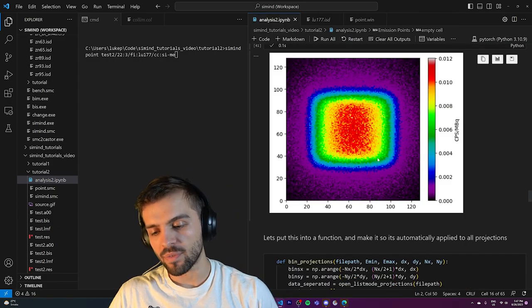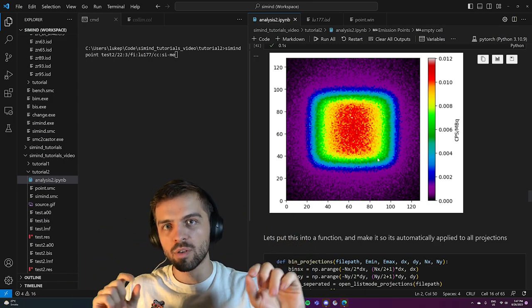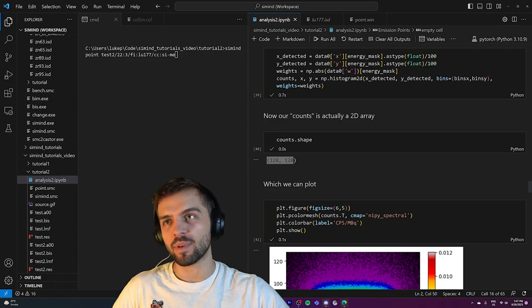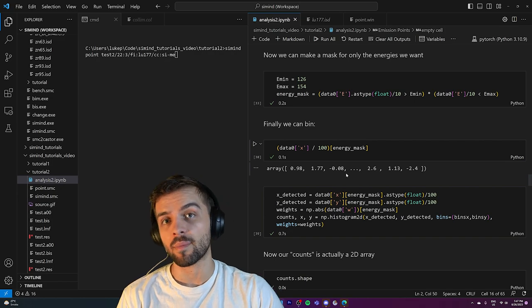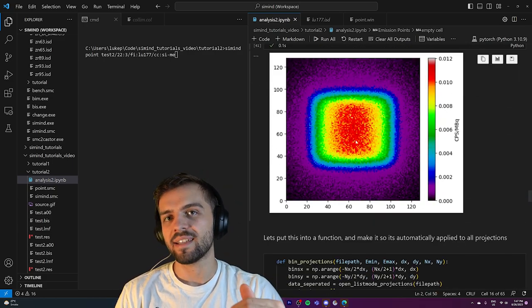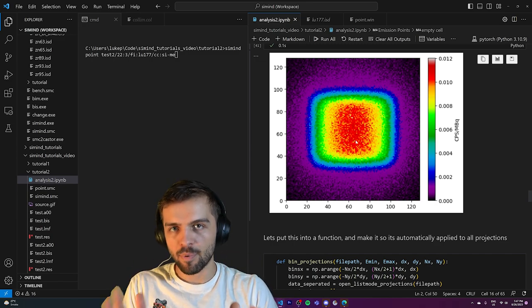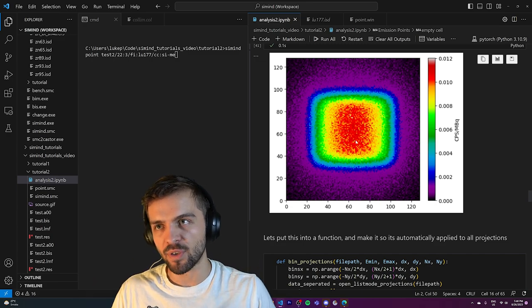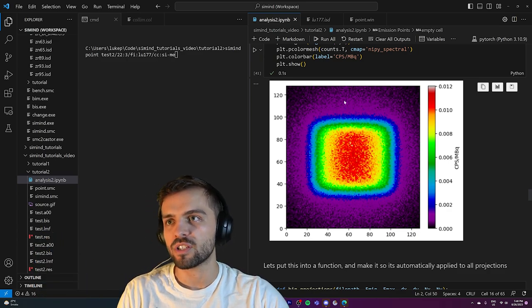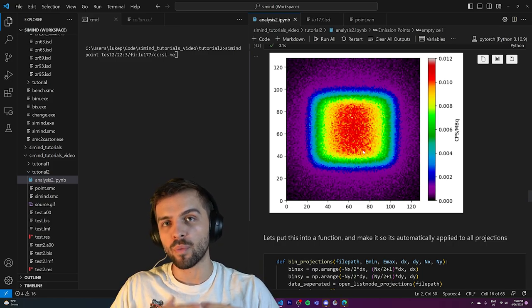In this video, we've done quite a bit. We looked at the raw list mode data from a SPECT scanner — the raw output you get access to when things are being binned. We looked at where photons are spatially located, we changed the energy resolution of the scanner and got a slightly more precise spectrum. We binned events based on positions, created our own projections, and saw why the scatter window routine is so nice: it takes care of basically everything we did in this video — it bins things automatically, separates them into different energy windows, and reduces the data size significantly.